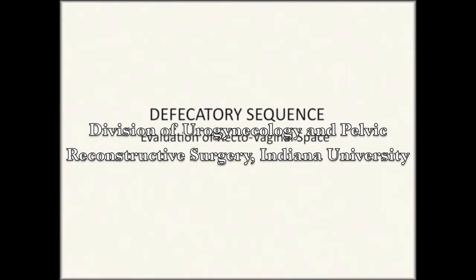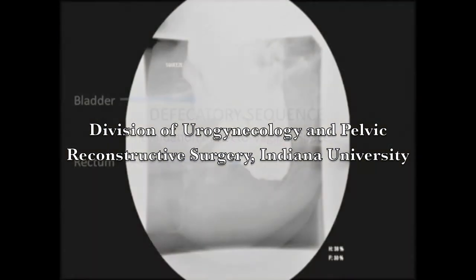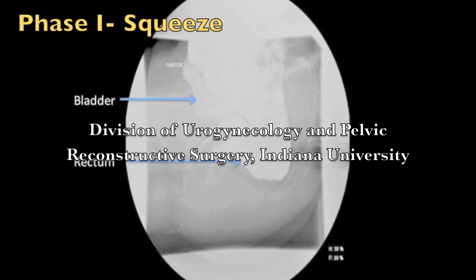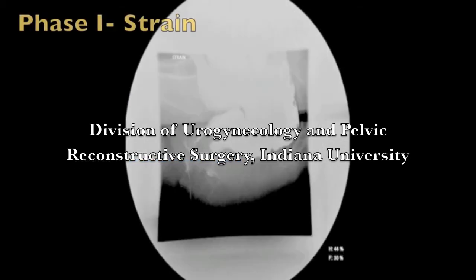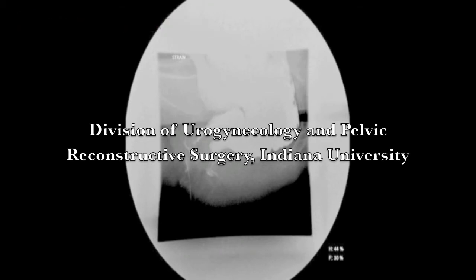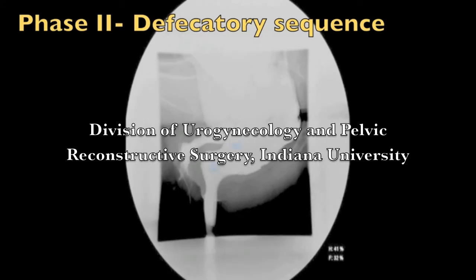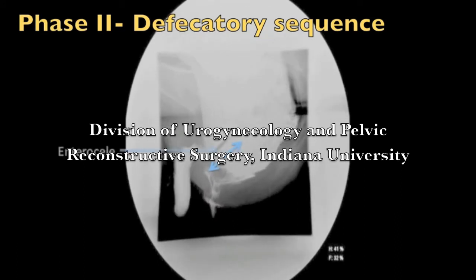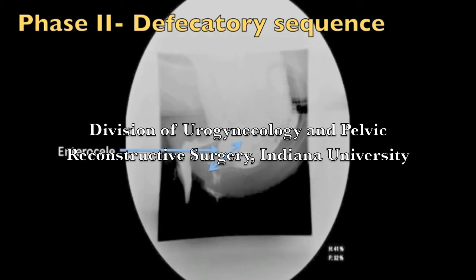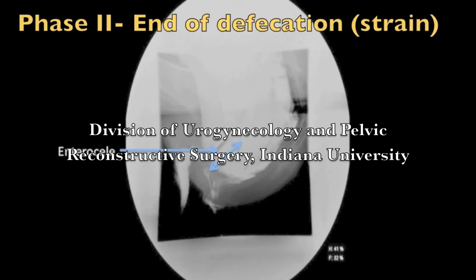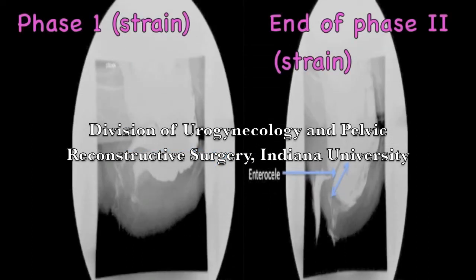Prolapse into the rectovaginal space is often underdiagnosed during physical exam. This is a patient with a chronic history of pelvic pressure and rectal fullness whose DCP was obtained because physical exam was not compatible with her complaints. When asked to bear down, no significant prolapse is seen, and the rectum filled with contrast gives the rectovaginal space a normal appearance. The defecatory sequence, however, shows a large enterocele filling up the rectovaginal space, causing contrast to be expelled from the vagina. Note the widening of the rectovaginal space caused by the enterocele. This demonstrates that the dynamic sequence is superior to static images in evaluating prolapse.